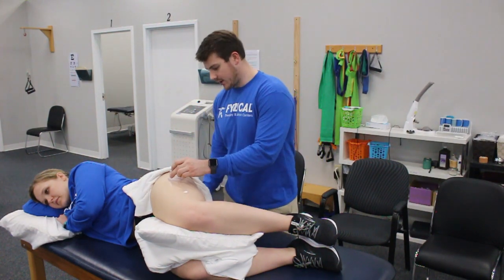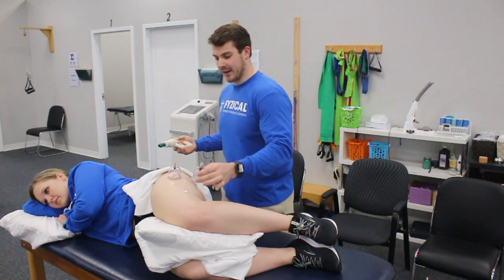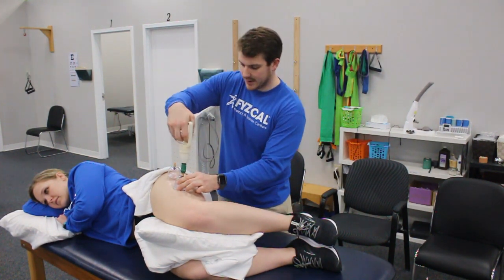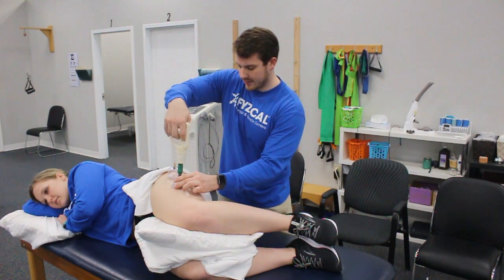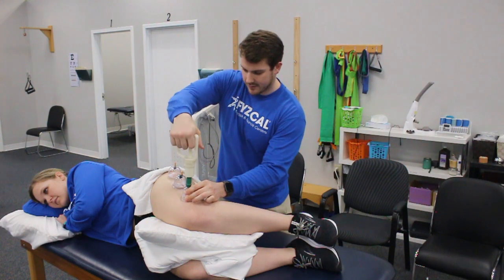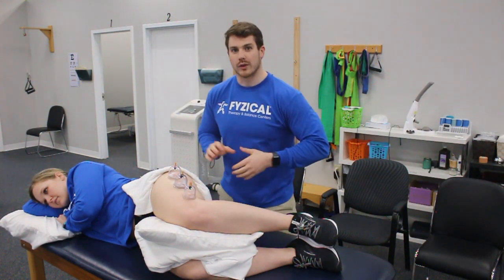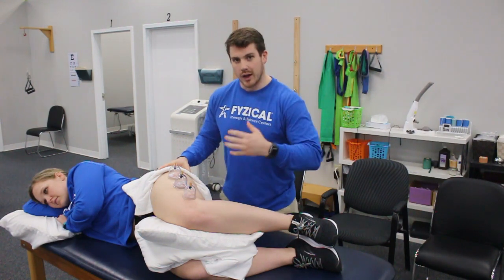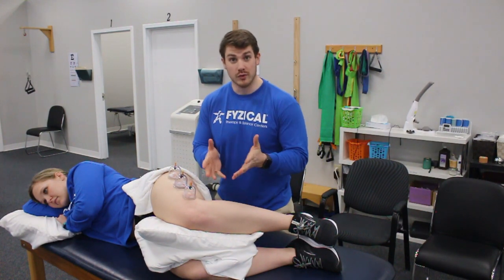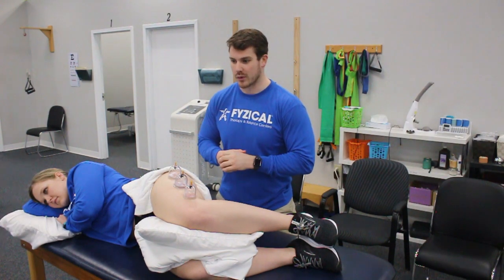Get the area lubricated and we're just going to follow the IT band down from the hip to the knee. Let those hold for a few seconds. We like to have the person move throughout this to get a little bit more blood flow and a little more motion through that area.